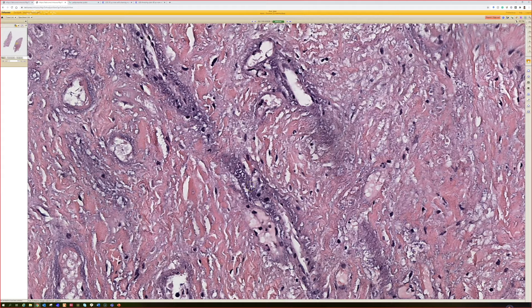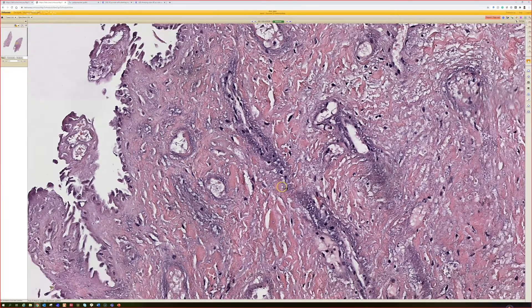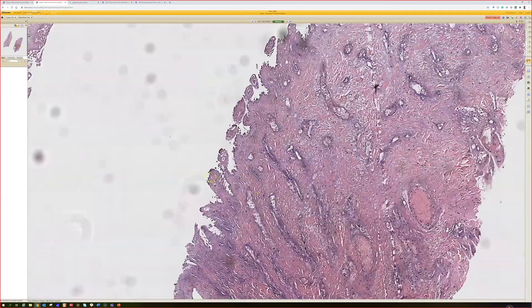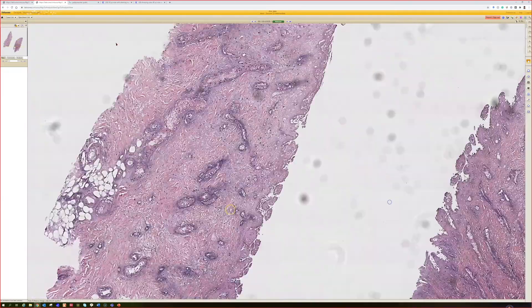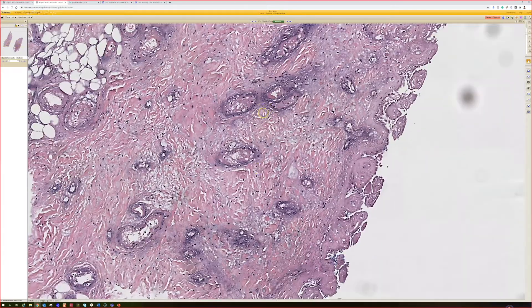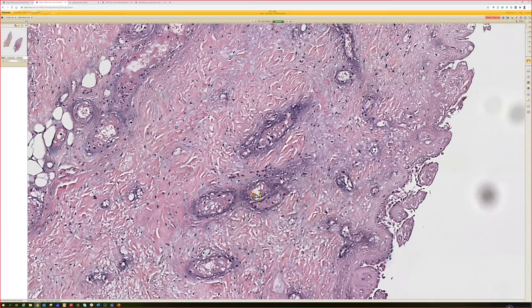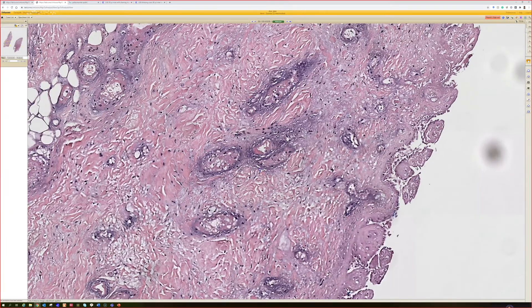You can't really see the individual distinct bacteria here. I'm not even sure if you can on a gram stain. My recollection is that Pseudomonas organisms are quite small — gram-positive cocci are hard enough to see, and I would imagine the individual Pseudomonas organisms would be even harder. Here's the tissue on the other side — again, look at that blue haze, a very good example of what this is supposed to look like.